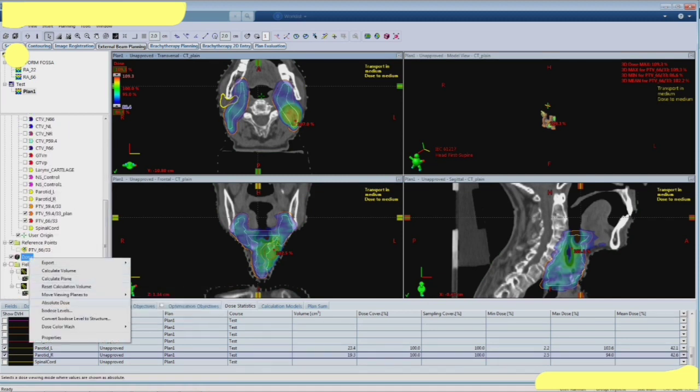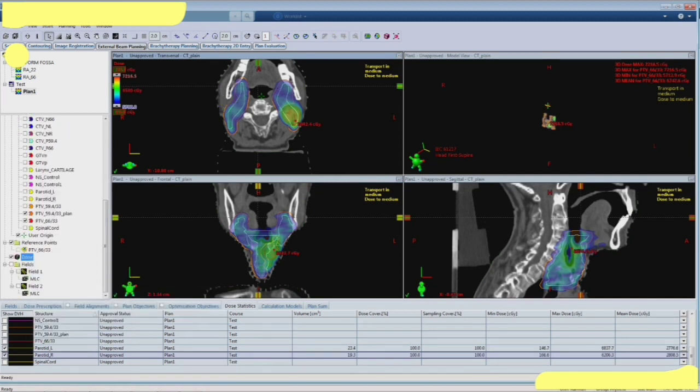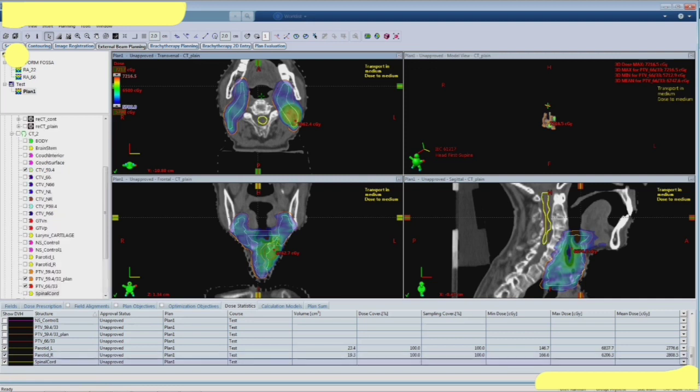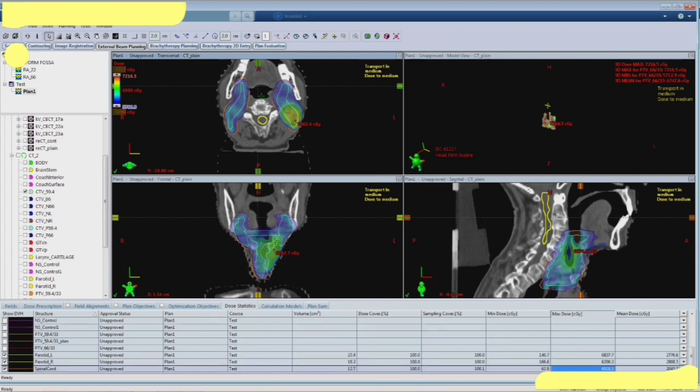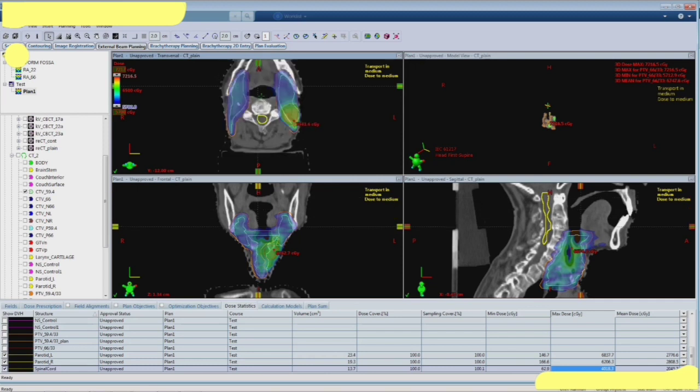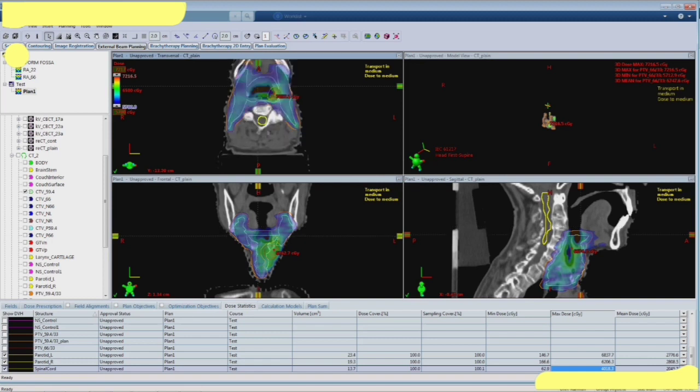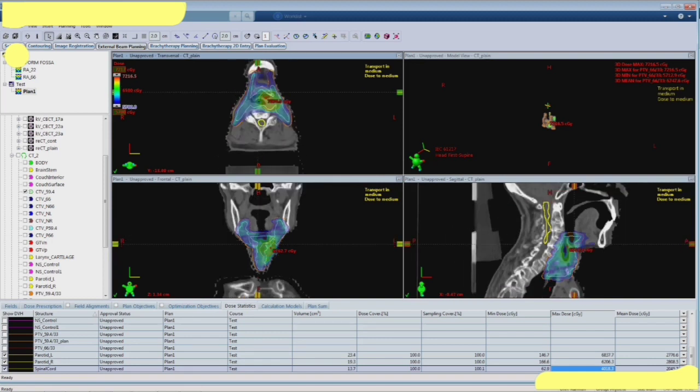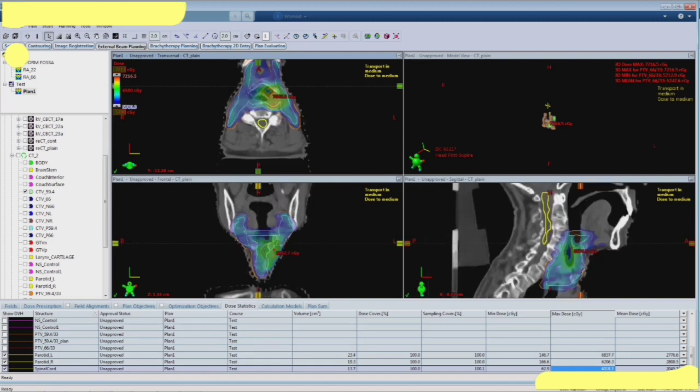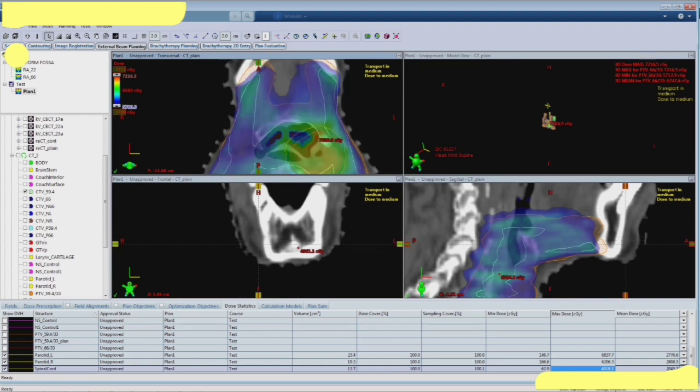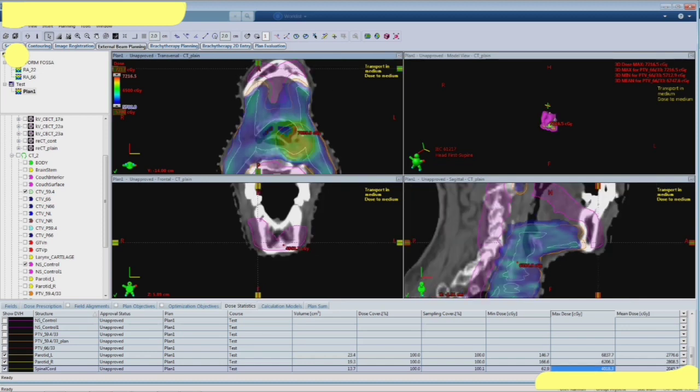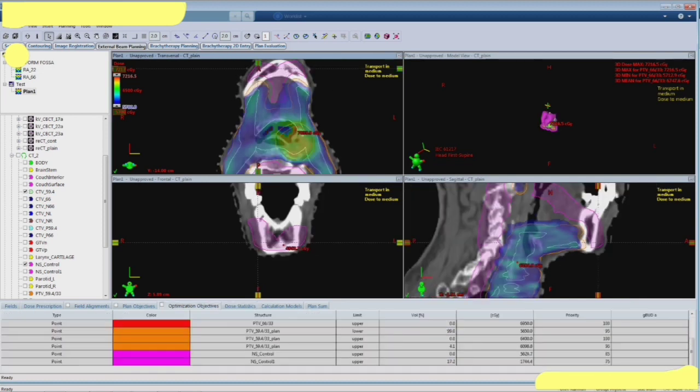So that is actually the DVH column, those statistics. There is underdose. So because of this controlled volume, there is underdose there in the PTV. So if the clinician is okay with that, CTV, by looking at the CTV coverage and everything and your department setup protocol and everything, then that's fine.